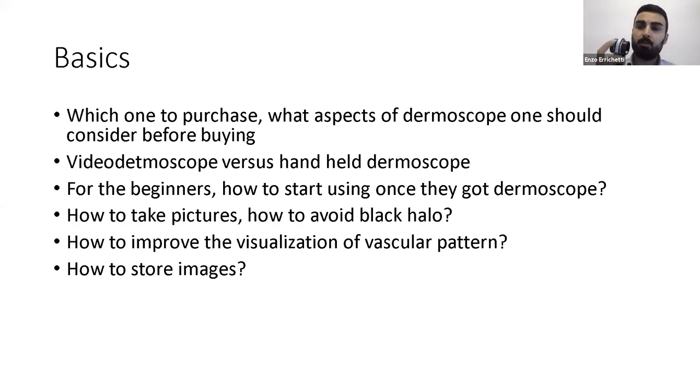we cannot see the vessels properly. And this is important also to take a picture, because we cannot take a picture without any contact with the skin, since we cannot focus the lesion very well. So I think that this tip may be very helpful. We can put the dermoscope like this, but the central part is not in contact. So I think that this is the best way to visualize the vessels. I don't know your opinion. Yes, that is a good idea. And it will be like a polar non-contact dermoscopy.